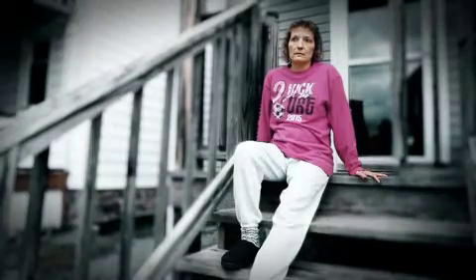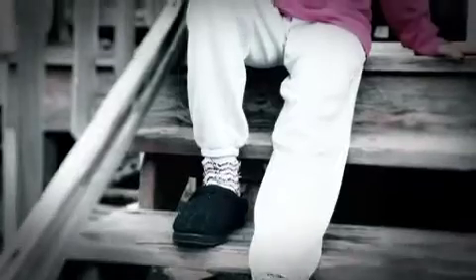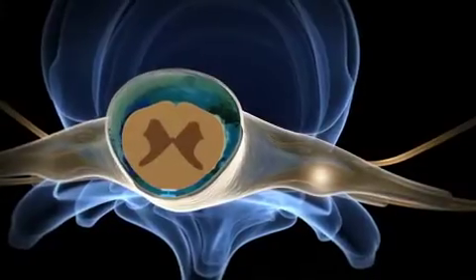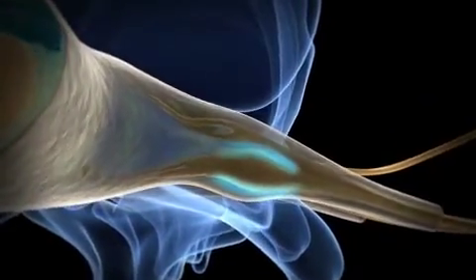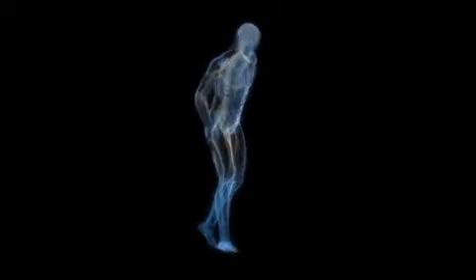When I first met Cam, she was suffering from groin pain for over 15 years, which came on after a hernia repair, in which there was injury to a single nerve causing groin pain, as well as pain that spread into the front portion of the leg. Historically, that's very hard to cover because it requires generation of a signal on a very select nerve root. DRG stimulation gave us the ability to focus that signal into a very small area and cover that painful area that our patient was suffering from.